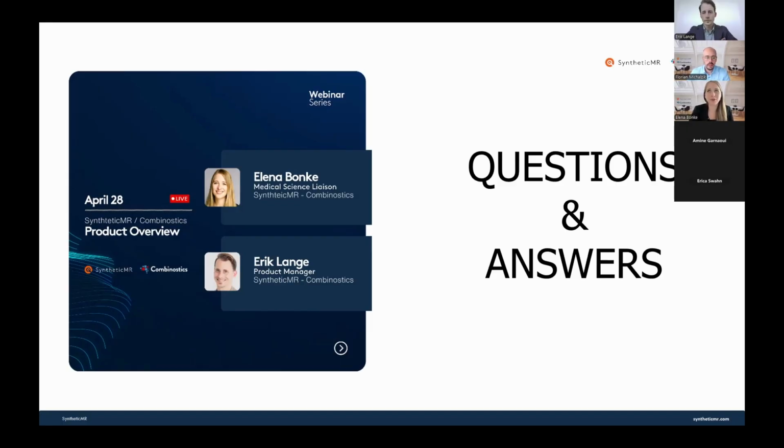Yeah, very important question. All the results that we're providing, especially the percentiles later on, are of course based on whatever data we have included in our normative database. So very good question. I can mention a few things on what is included there. It's a very large database, as I said before, more than 10,000 healthy controls, also coming from different sources, let's say. So it's 21 different projects or different sites involved there. It's both publicly available data, but also some data from our collaborators.